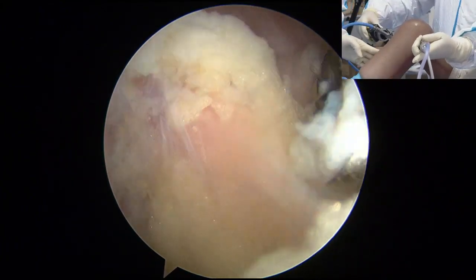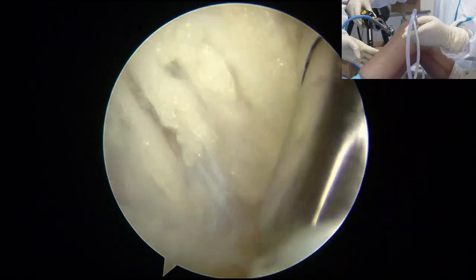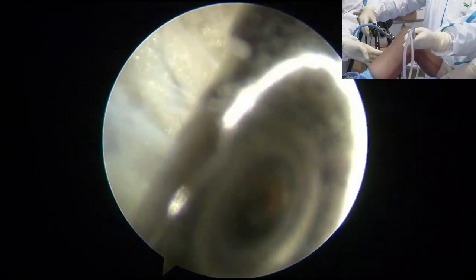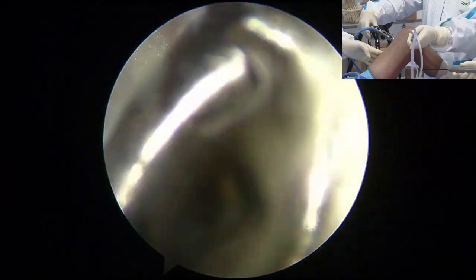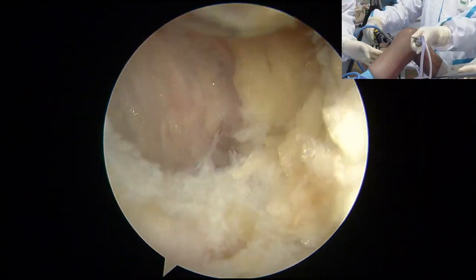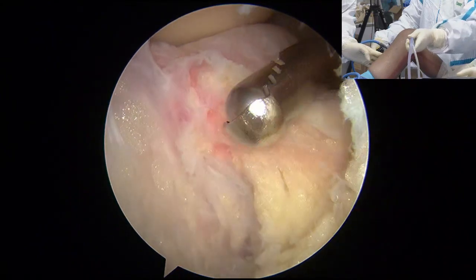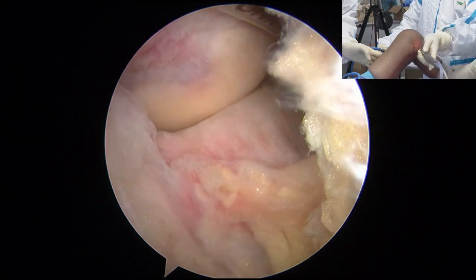Okay, good. Yeah, you slowly go down. That's PCL, right? Slowly go down. The PCL is near here, so we must slow down. Right, okay, here, PCL. Okay, turn the shaver blade away from the vessels. Higher. The shaver opening should not face the vessels. Okay, that way. Remove this. Okay, that's better. See? Pressure is better, so the joint is dilated now. See? Better. Okay, now the clearing is mostly done and the view is much better.